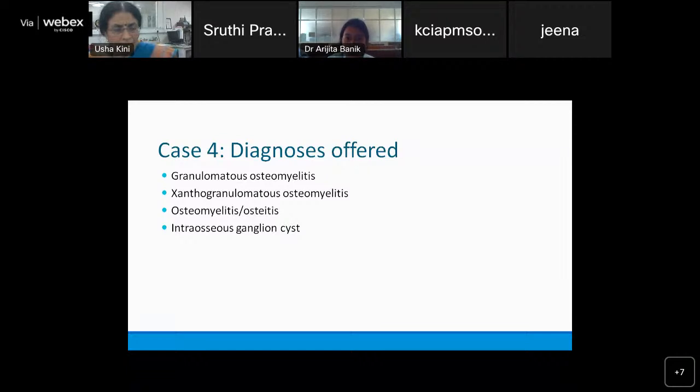No, ma'am. Ganglion cyst. I think they must have got confused with the synovium lining. I don't know how they made the diagnosis of ganglion cyst. You know, I'm not sure. Fibrous dysplasia. Do you agree to fibrous dysplasia?